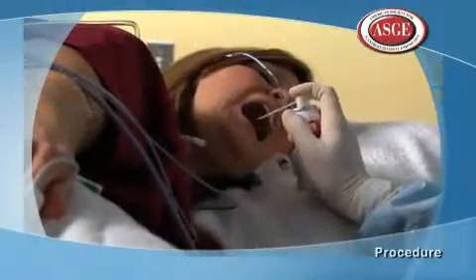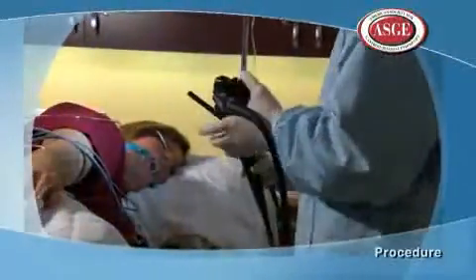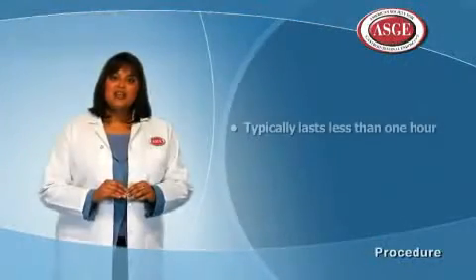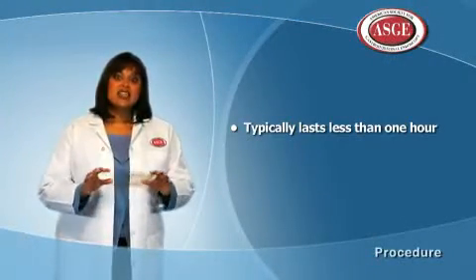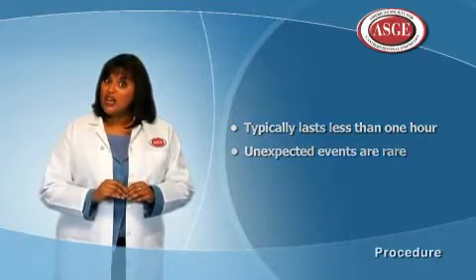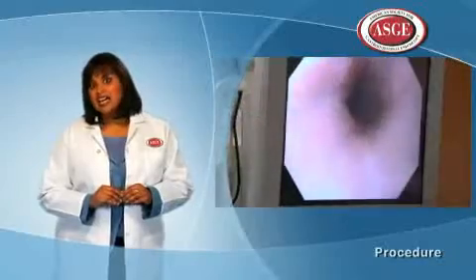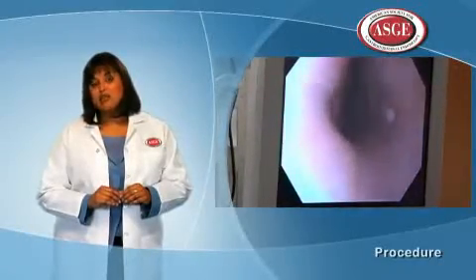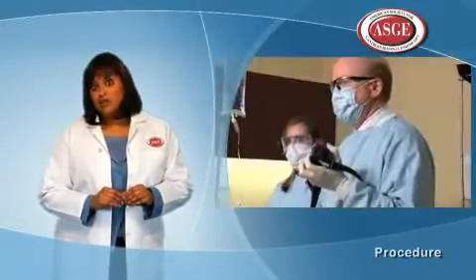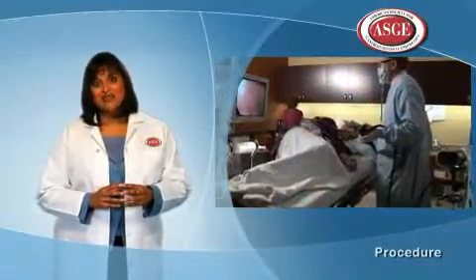Just before the procedure, your doctor may spray your throat with a numbing agent to assist in passing the endoscope, a thin, flexible tube, into your stomach. Upper endoscopy typically lasts less than 1 hour. Unexpected events are rare, but do occur. Complications of endoscopy may include making a tear in the lining of the gastrointestinal tract, bleeding, breathing problems, or a bad reaction to the medication used for sedation.